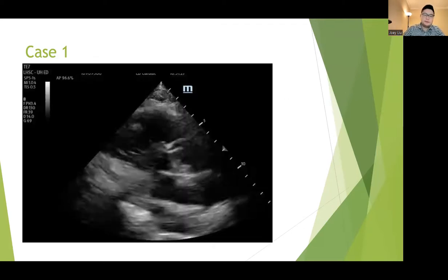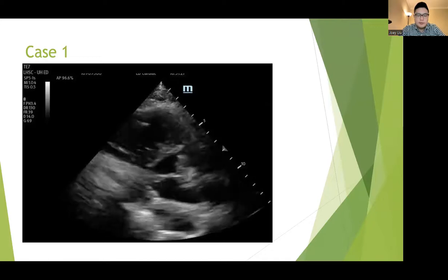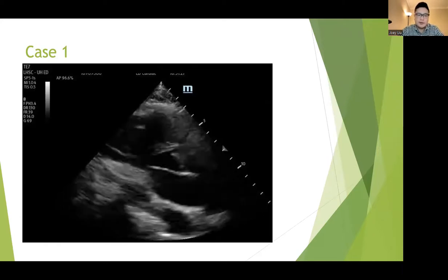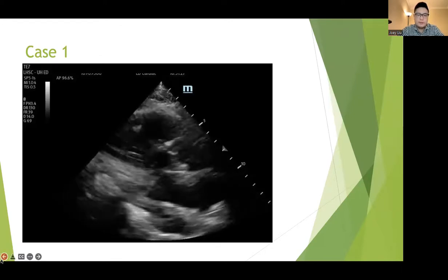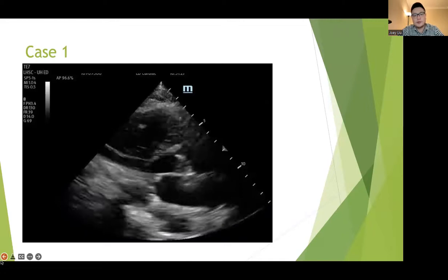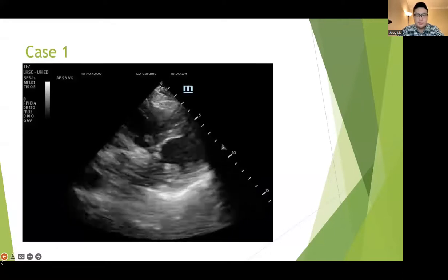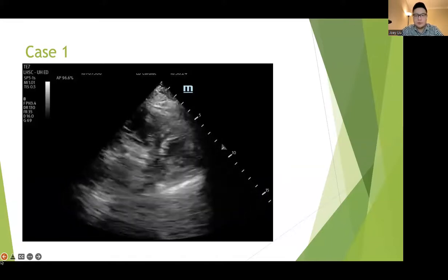I began with the cardiac POCUS study, starting with the parasternal long axis view. Even though he had a previously documented TTE of 20 to 25%, I actually thought that his systolic function didn't look too bad. You can see the mitral valve extending into the left ventricle quite well, and the endocardial contractions of the ventricle are pretty good, coming together. Looking at the parasternal short axis view, it seems like he may have regained some LV systolic function between his measurement and when I saw him.